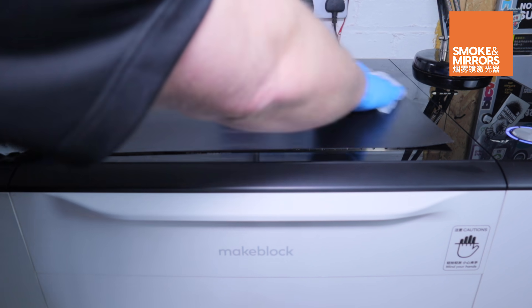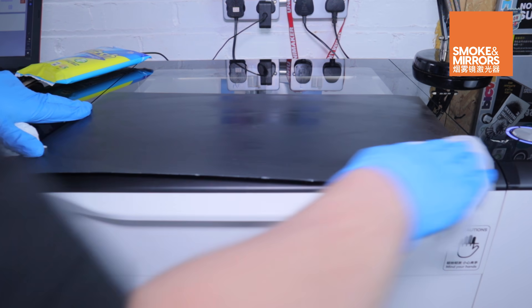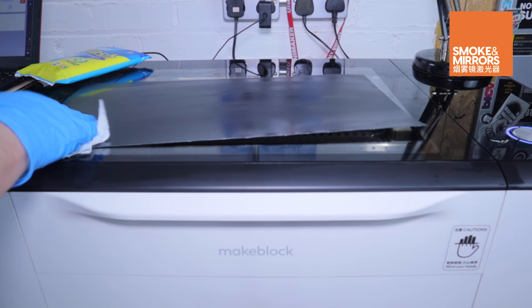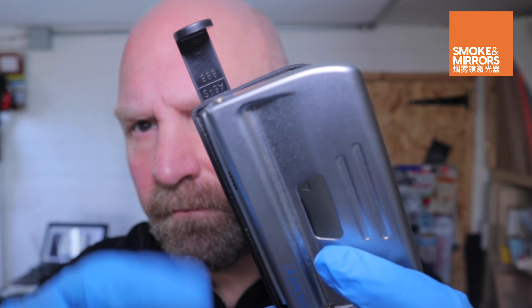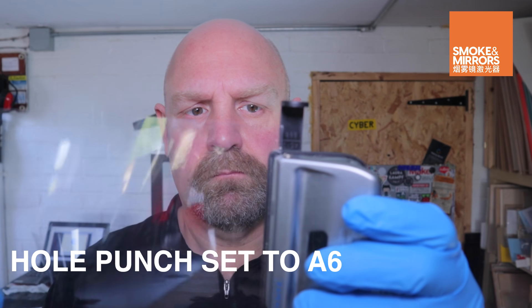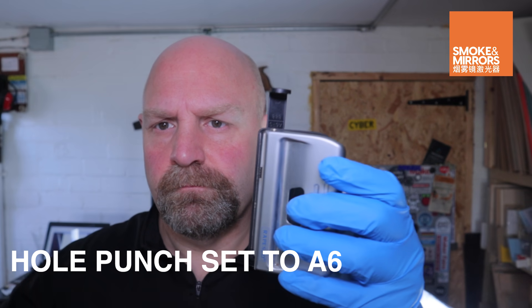Sheet material can easily be wiped down before and after cutting to keep headbands contamination free and clean. The PVC binder sheet can be made ready for fitting with a 2 hole punch set to the A6 setting. Punch the holes at one end of the landscape binder sheet, flip it lengthways and cut holes at the other end.